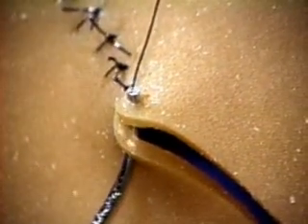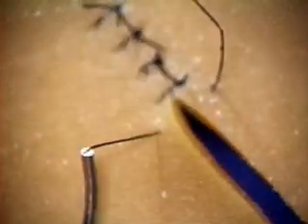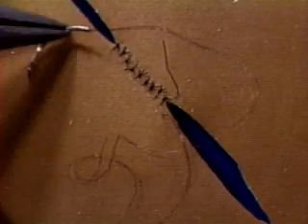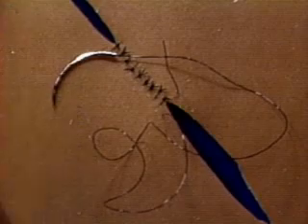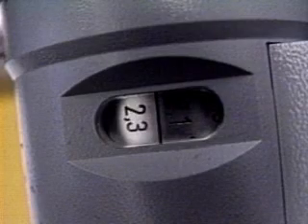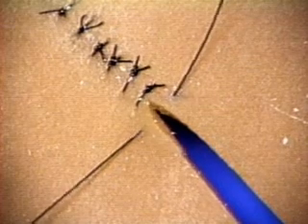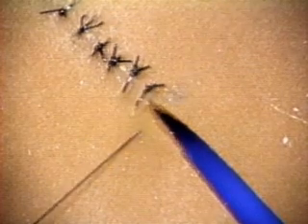In pulling the needle through, avoid a sideways pull on the needle or on the thread. Having pulled the thread through, avoid bringing the needle back into the field of view. Lastly, avoid using the wrong magnification. If you have it too high when you're picking up the needle, or too low when you're going through tissue, or again too high when you're pulling the thread through, you just can't do the job. I've given you a lot to remember already. Let's stop the tape and take a break.